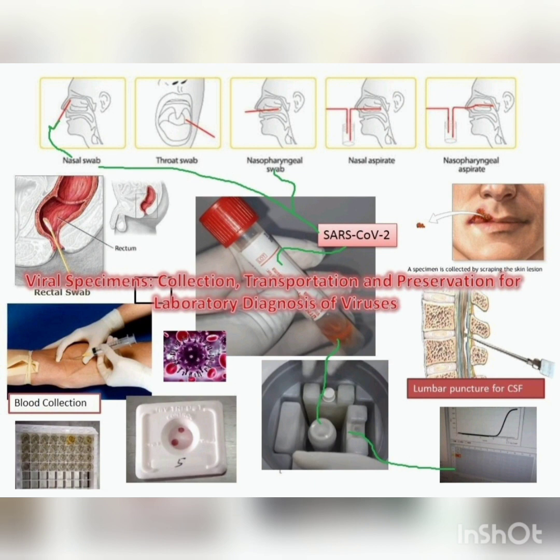And the second point is, the specimen or material needs to be collected where the suspected organism is most likely to be found. It means you need to collect the specimen from the particular point where you can find the organism. Take an example: to diagnose corona infection, they collect the swab from the nasopharynx or oropharynx. Why?